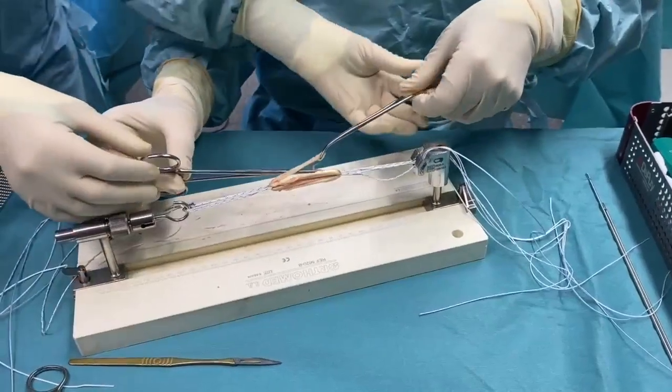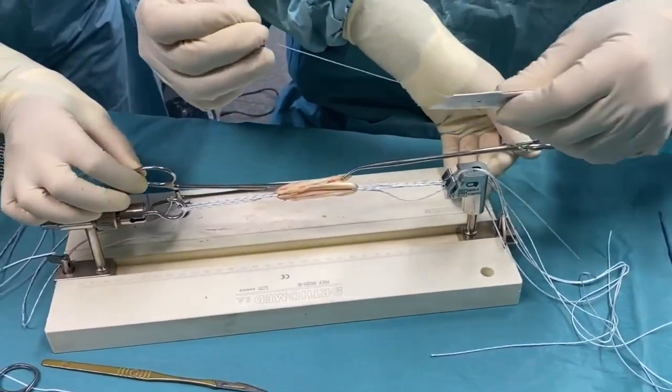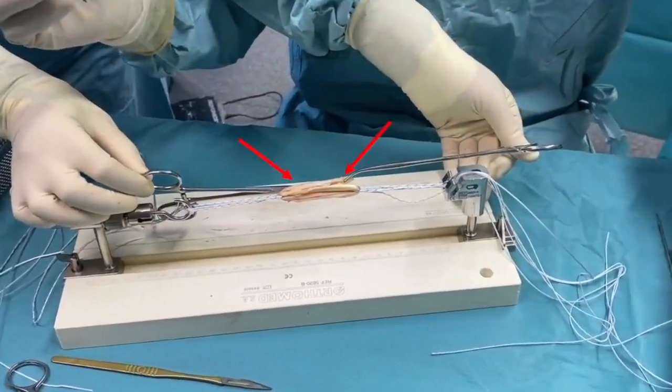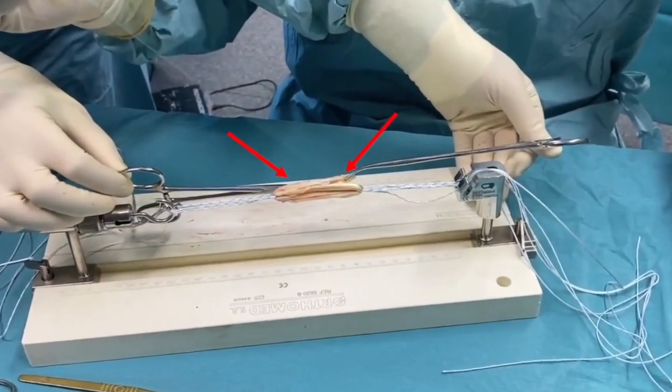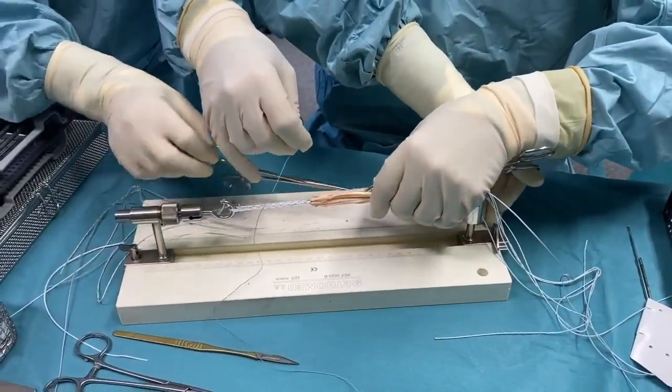The disadvantage of this is that it creates two areas of opposition at the end of the graft, which can create areas with uneven diameters. Moreover, advancing these ends is more difficult because of the presence of the clamps in the surgical field.